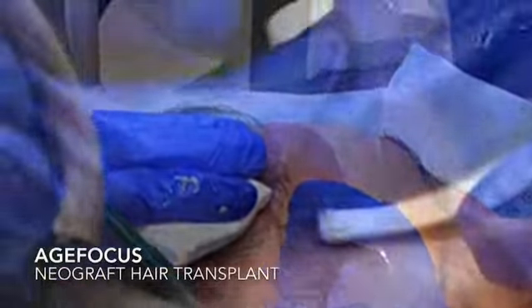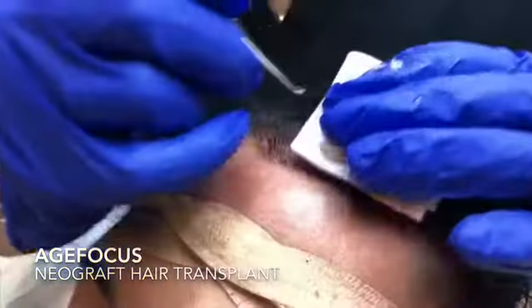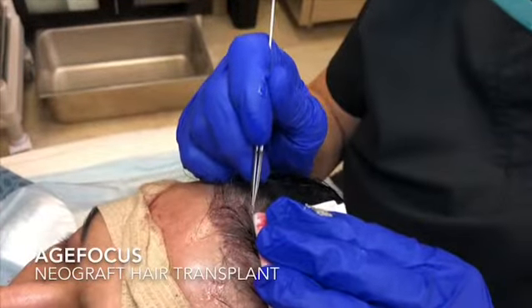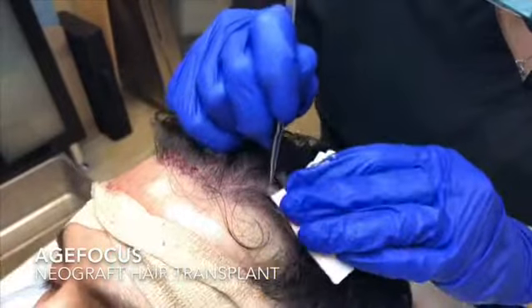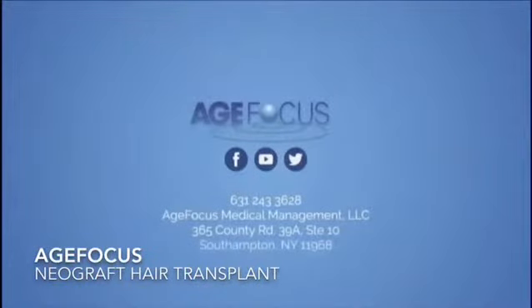Each individual follicle is then implanted into the recipient site for full and natural looking results using your own hair, with no linear scar and fast recovery. Call AgeFocus today for your complimentary evaluation tailored to your individual needs.